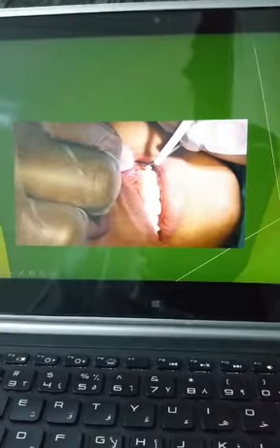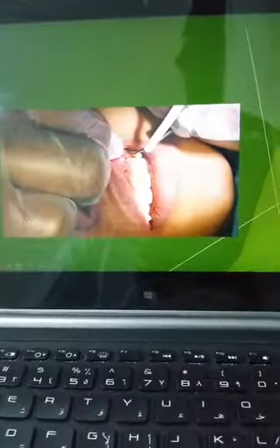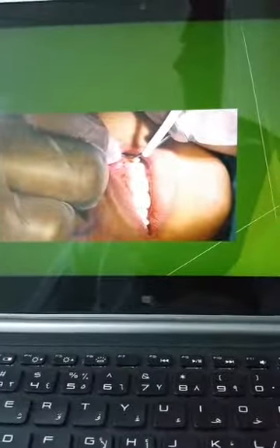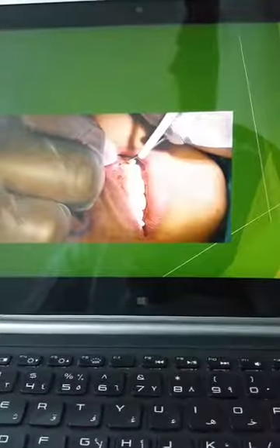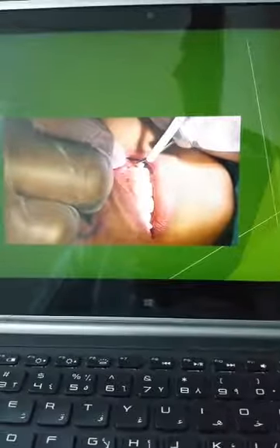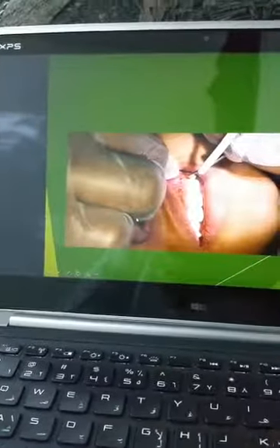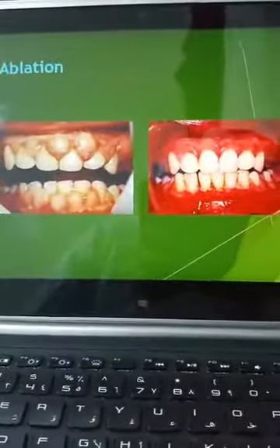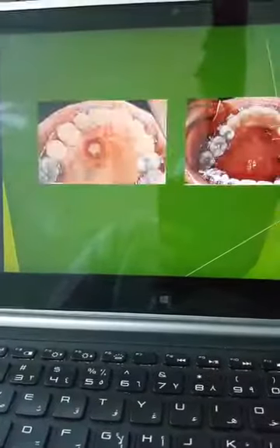You have to be parallel to the tooth, trying to avoid directing the laser to the root apex, especially if you have an orthodontic case where the teeth are sometimes almost outside of the alveolar bone. You could use ablation or gingivoplasty to reshape the tissue.